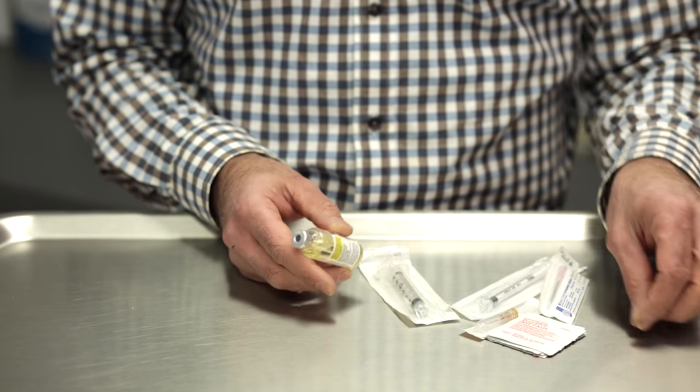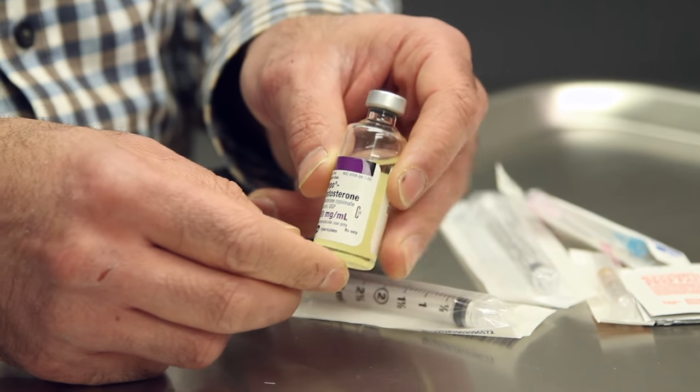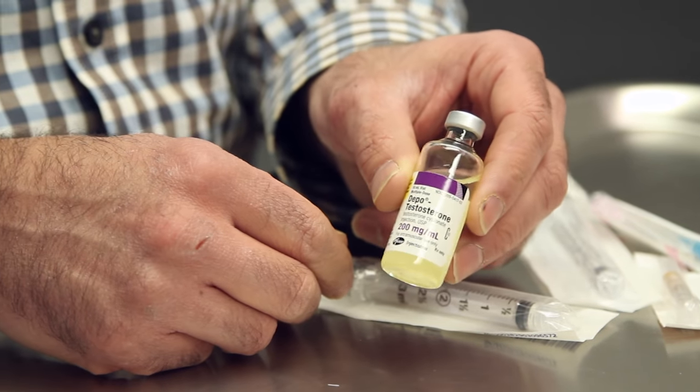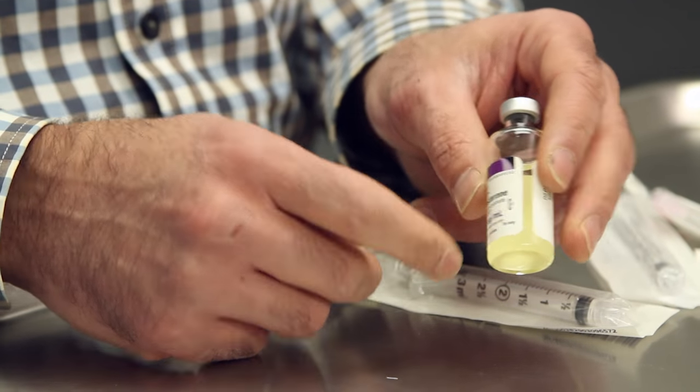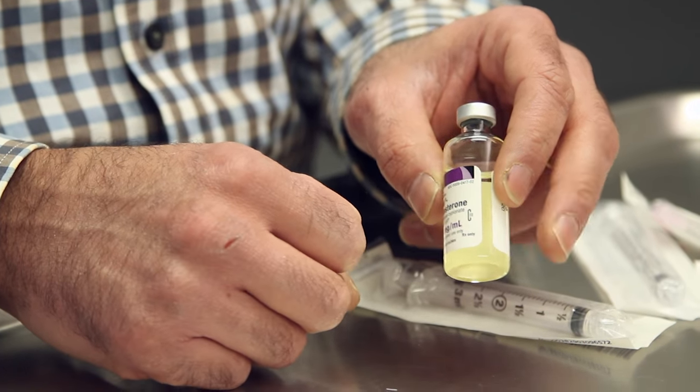Once you've removed the top from the testosterone bottle, you can now use the rubber stopper to draw your medication. This is a multi-dose vial — you'll be able to use this vial until you've completed all the liquid that's in the bottle.